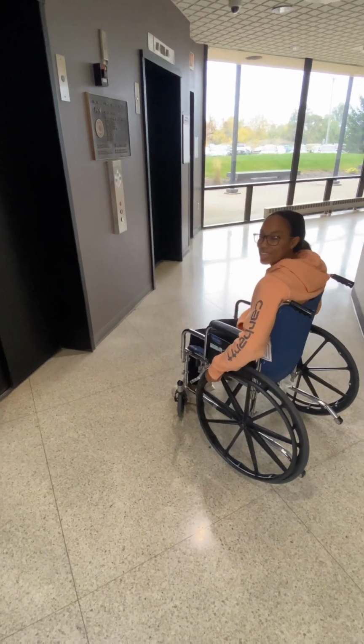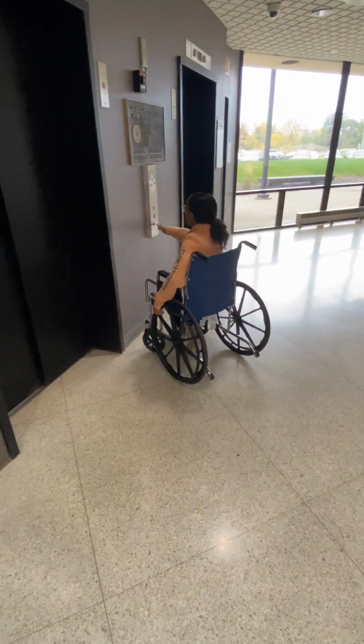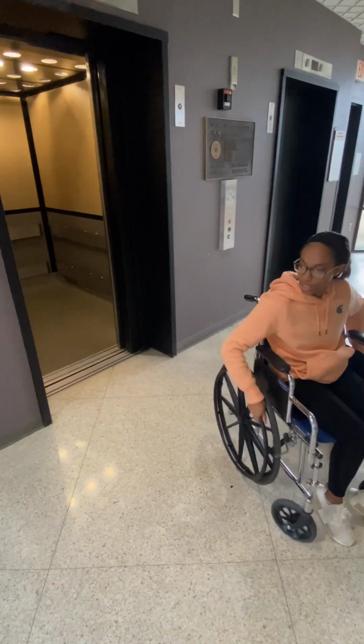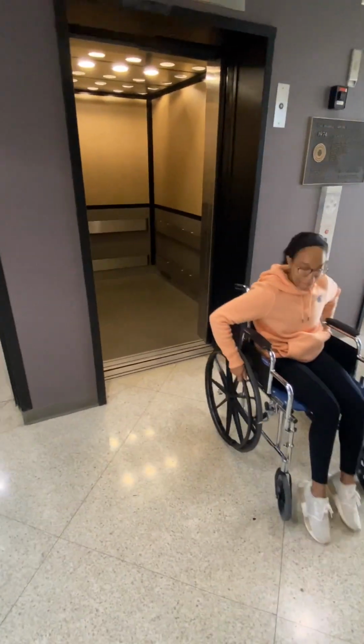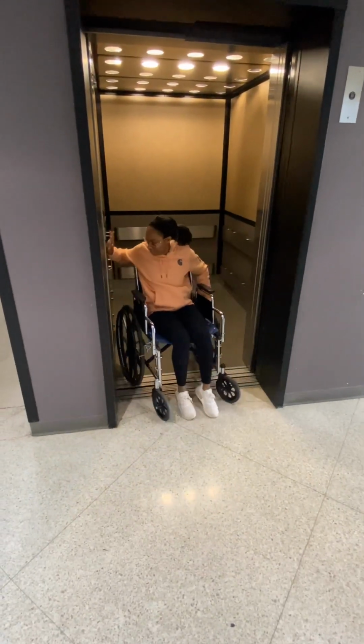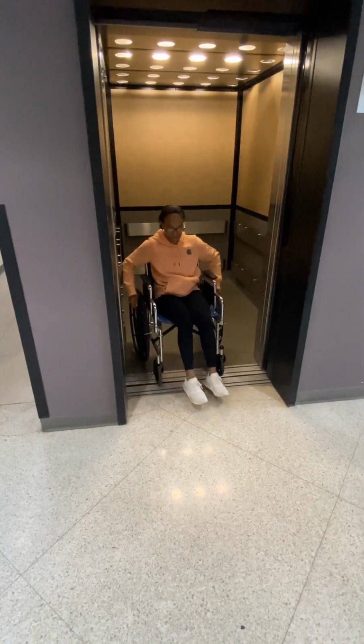Ready, set, go. Alright, so we're going to go backwards into an elevator. We're going to press the up button, rotate around to slide back into the elevator, and then when it's time to leave the elevator, you just go forward.